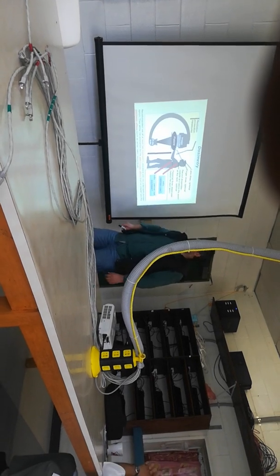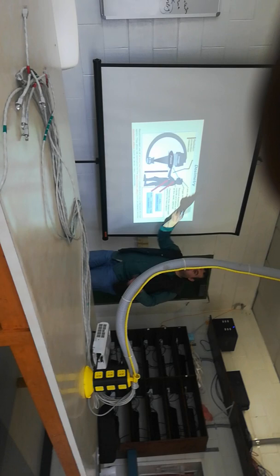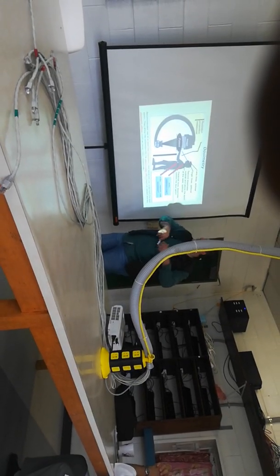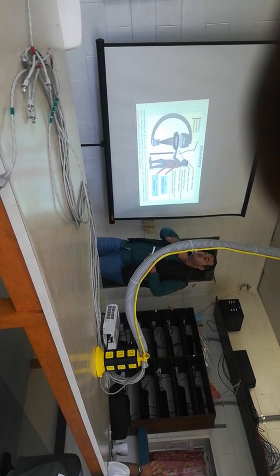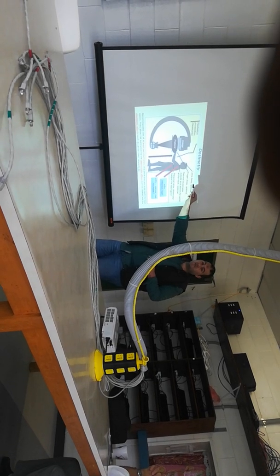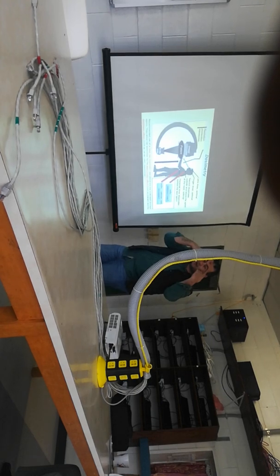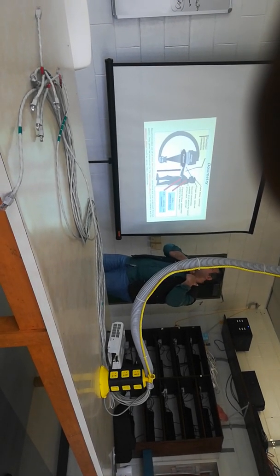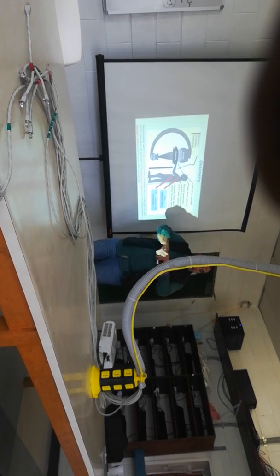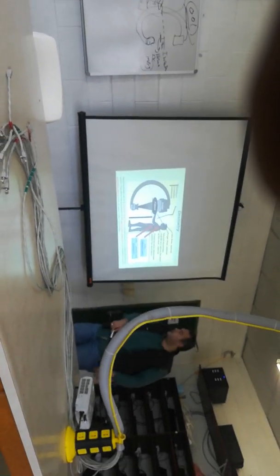This is for the worker, patient, image intensifier, X-ray tube. You'll find here that our lens is exposed to radiation, fingers and hands are exposed to radiation, and this region, the neck, is exposed to radiation. These are the locations for personal dosimeters, to measure the lens dose, the neck dose, our total body dose, and our hands dose. You'll find here 4 locations for dosimeters.